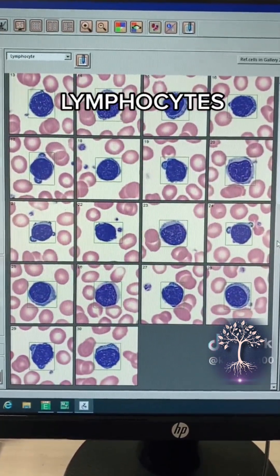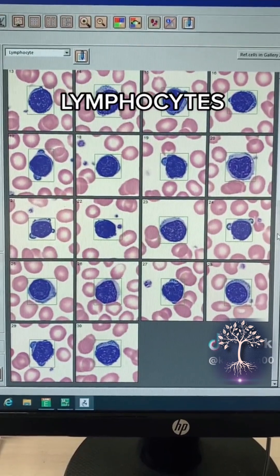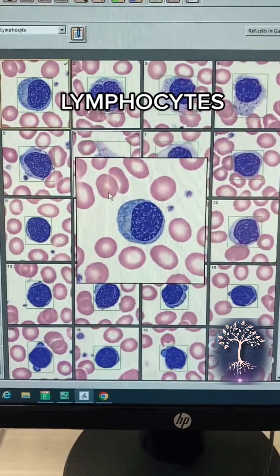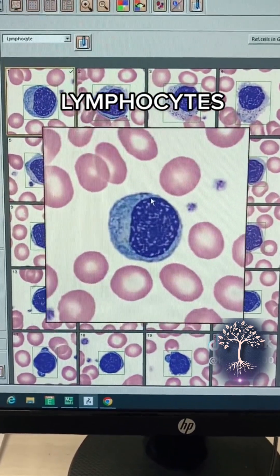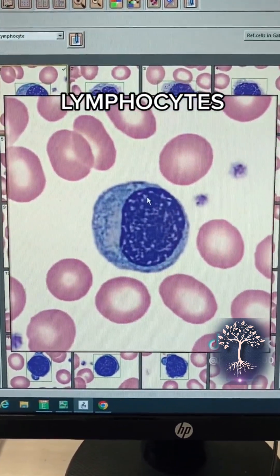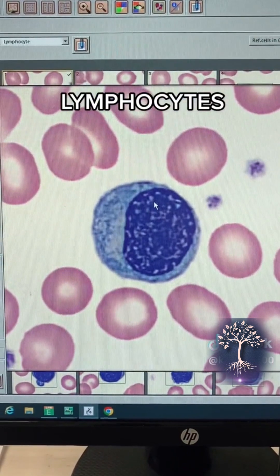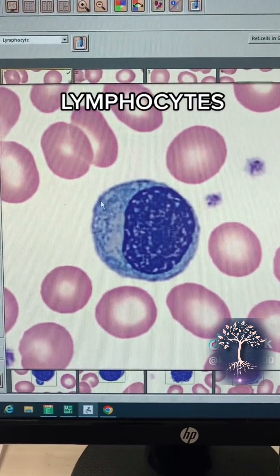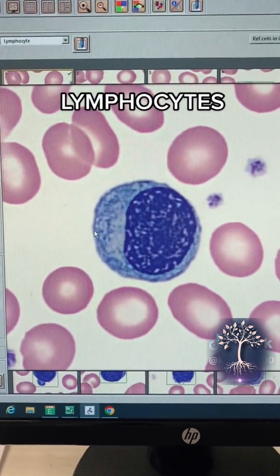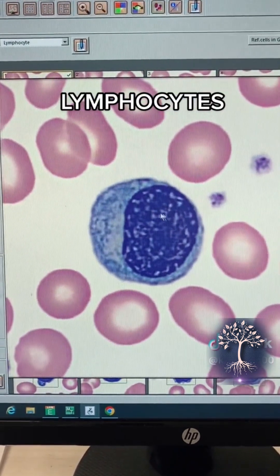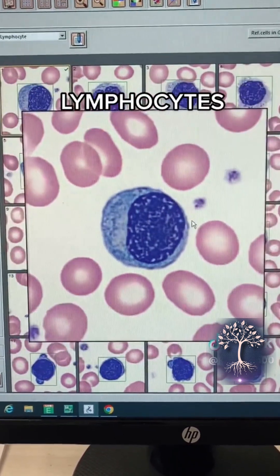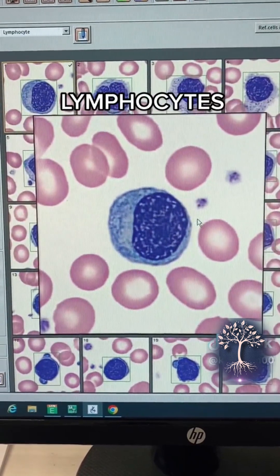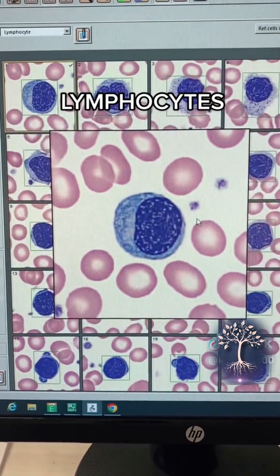Next we have your lymphocytes. Your lymphocytes can vary in size — you could have small, medium, or large lymphocytes. Lymphocytes have a light purple jelly-like cytoplasm and then the nucleus is large in the center.